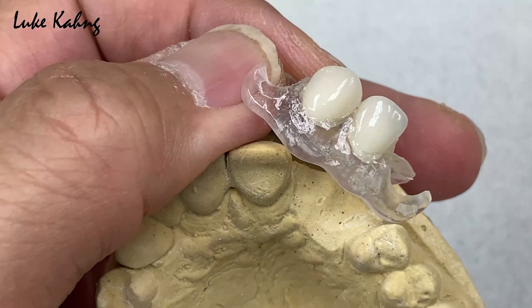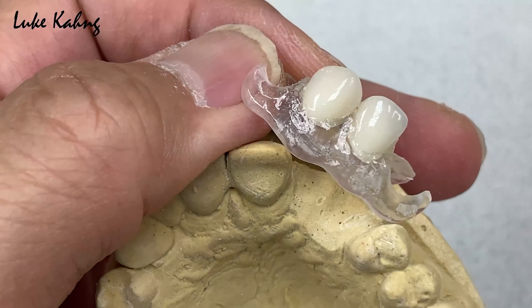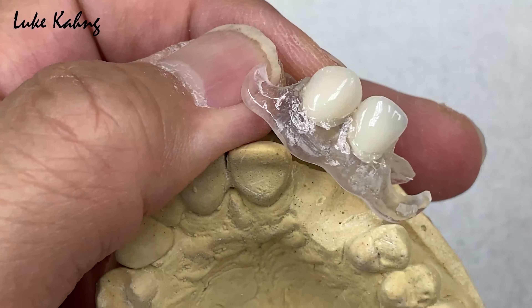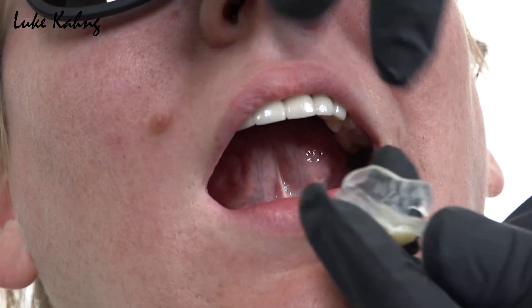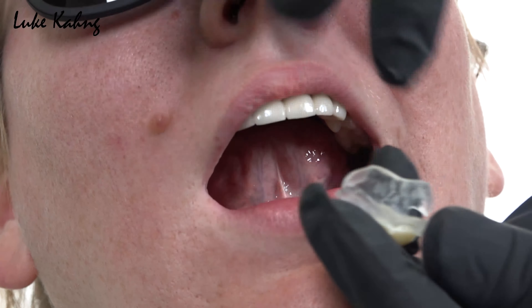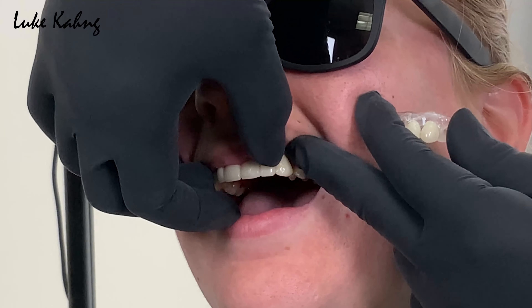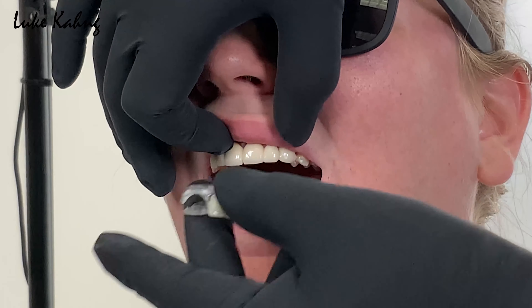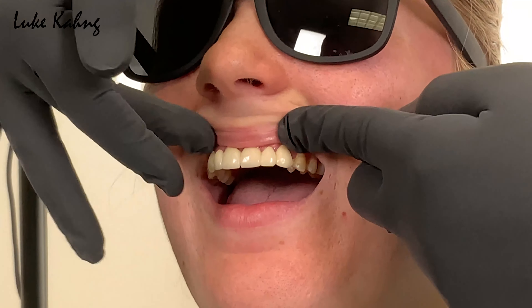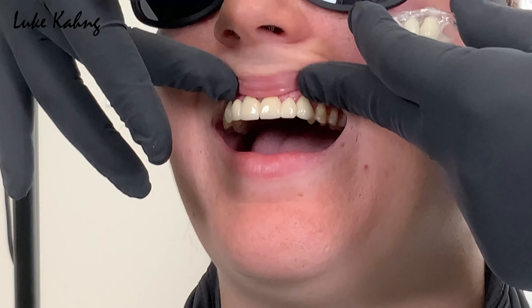We chose the TCS unbreakable partial — clear, injectable, flexi. The dentist will remove teeth number 10, the lateral, and the canine, place the implant, and the patient can wear this clear flexi partial. Color matching is good. For the future, after healing, we can make another six-unit bridge, and I also made a custom tray for future impressions so the doctor can take a great impression. The clear color means tissue will show through from the inside.